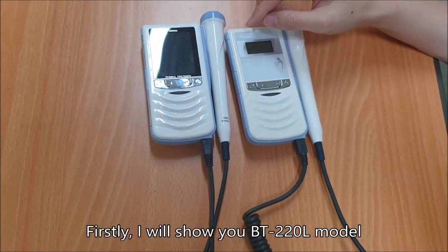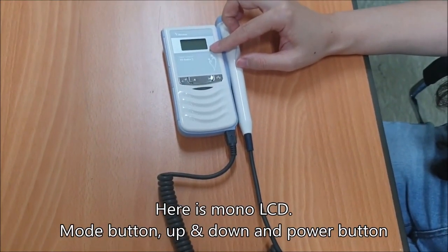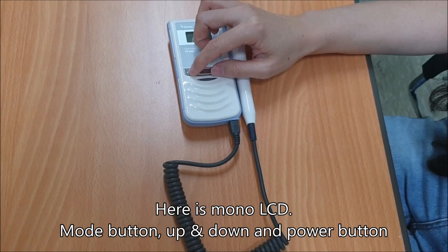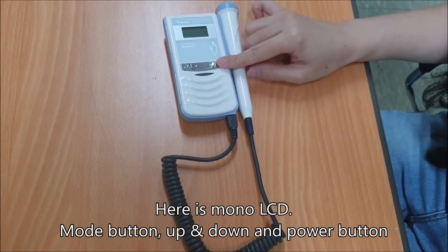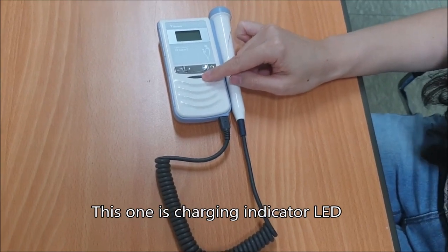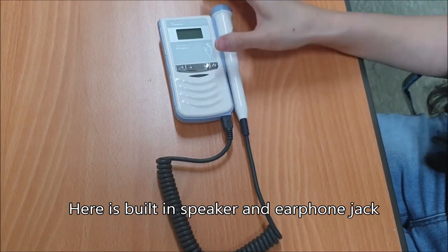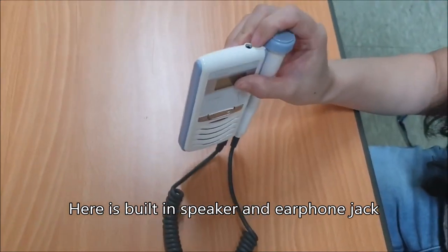First, I'll show you the BT-220L model. Here is the mono LCD, mode button, up and down buttons, and power button. This one is the charging indicator LED. Here is the built-in speaker and earphone jack.